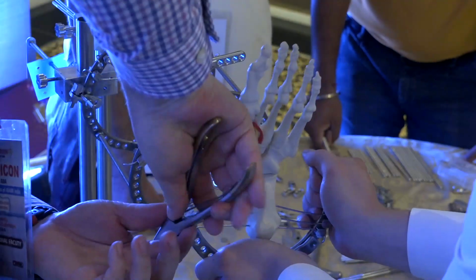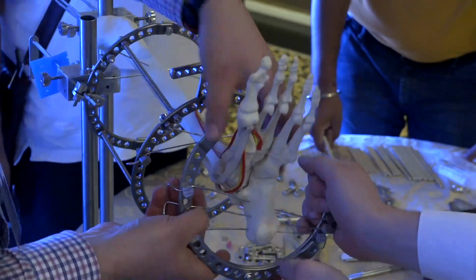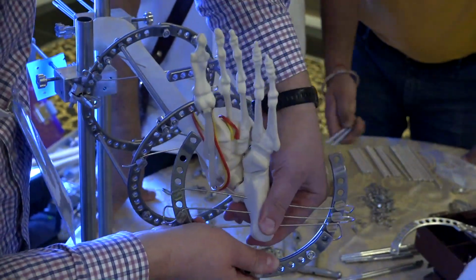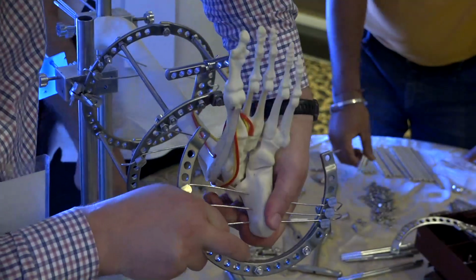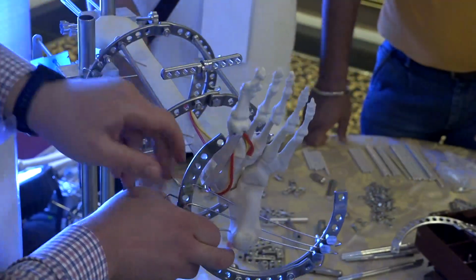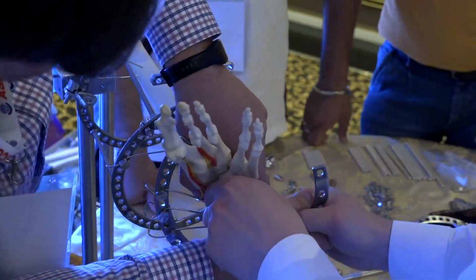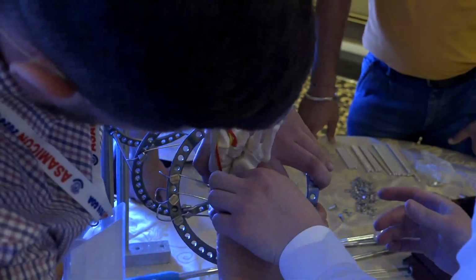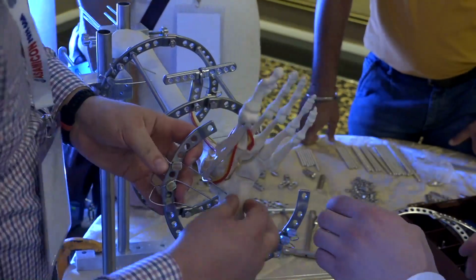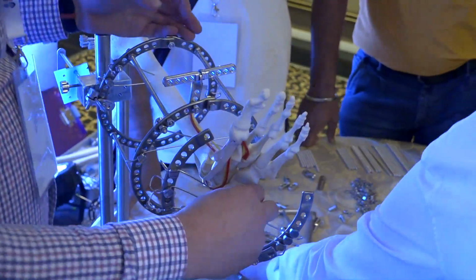Now we will fix it. So actually, you can see parallel wire fixation is too strong, not moving. Can we use an olive wire here? Olive wire I didn't like to use in the foot.